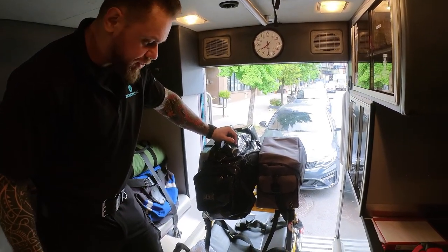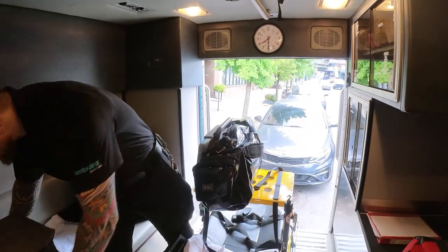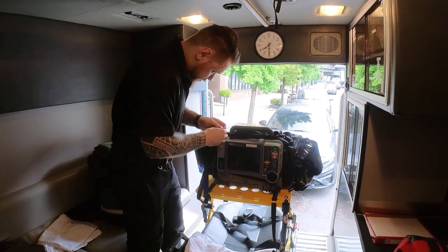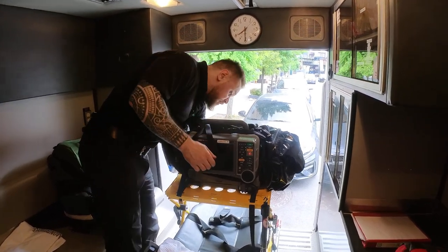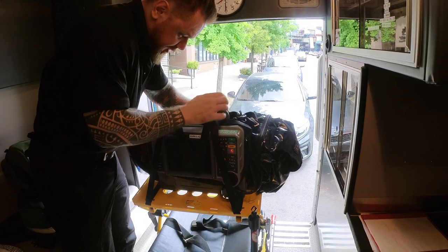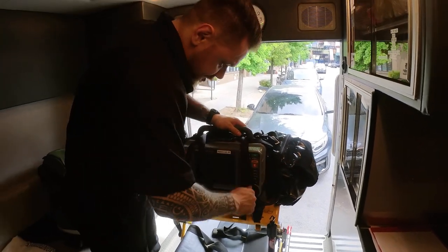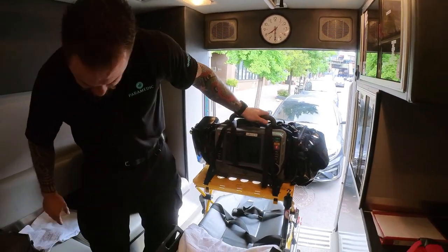I'll take the stretcher out so you can see the full assembly. I'm running the strap under the handle — not over it — to make sure everything is secure. I always double-check that we've cinched everything down. Now everything looks good. I'm taking the stretcher out to show you how the full assembly is housed.